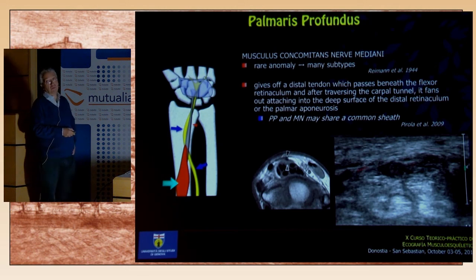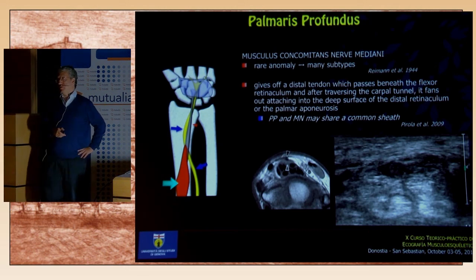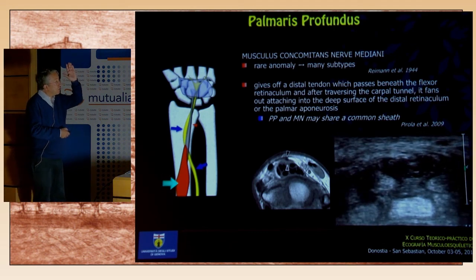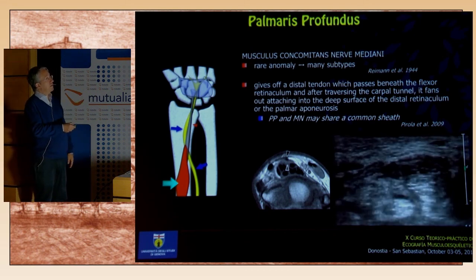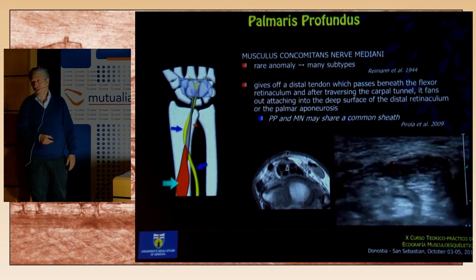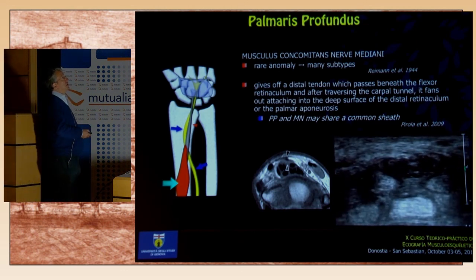This was a case of a carpal tunnel syndrome. You see the swollen median nerve. This is the tendon. During contraction, you see the tendon going to clash again with the median nerve, going to compress. You see the saddle-shaped deformity of the median nerve induced by the tendon.